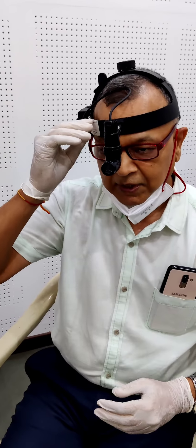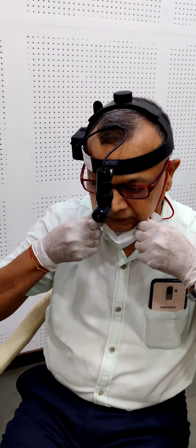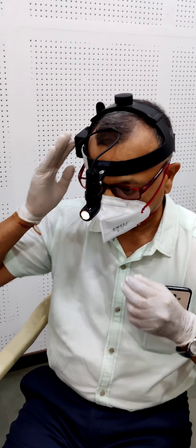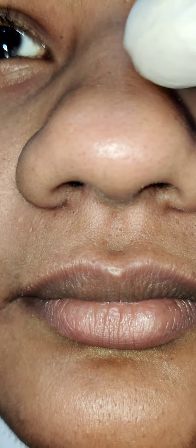Now we will begin the examination. During the examination, first we will examine the external nose. We should see the shape of the nose. We can look for any crookedness, deviation, or any sort of hump on the dorsum of the nose — that we should note.